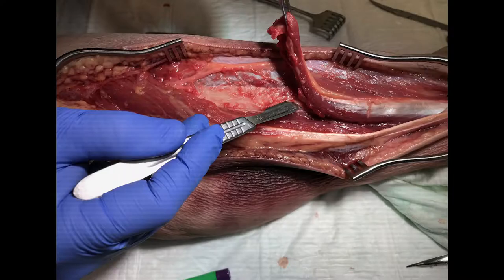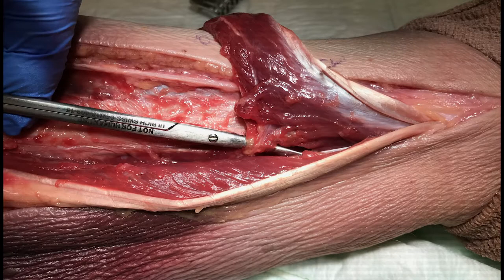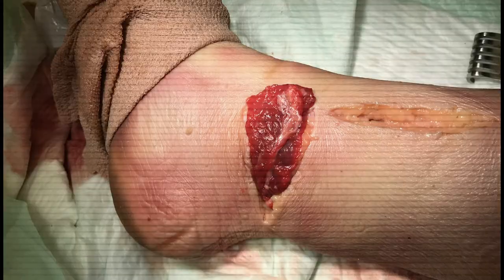Exposure, harvest, and transposition of the distally-based peroneus brevis muscle flap does not require microvascular techniques and can be successfully performed by most orthopedic surgeons.